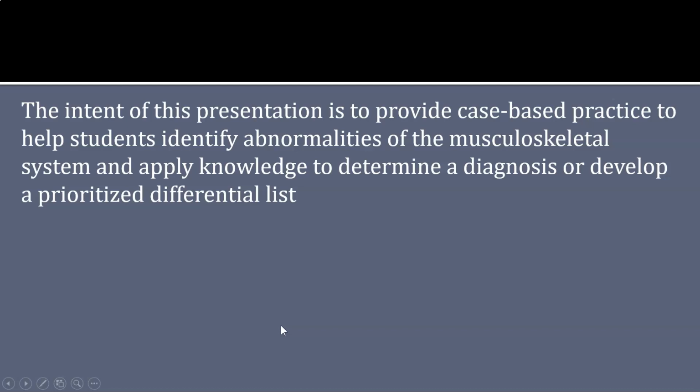Although I won't spend too much time reviewing each study in this presentation, remember that you should be practicing review of studies by finding a systematic approach that works for you and then being sure to use it consistently and review the entire image for each study each time. And I want to encourage you to always practice writing your findings down and being as descriptive as possible using the correct anatomic and radiographic terms before you then come to conclusions on each study.